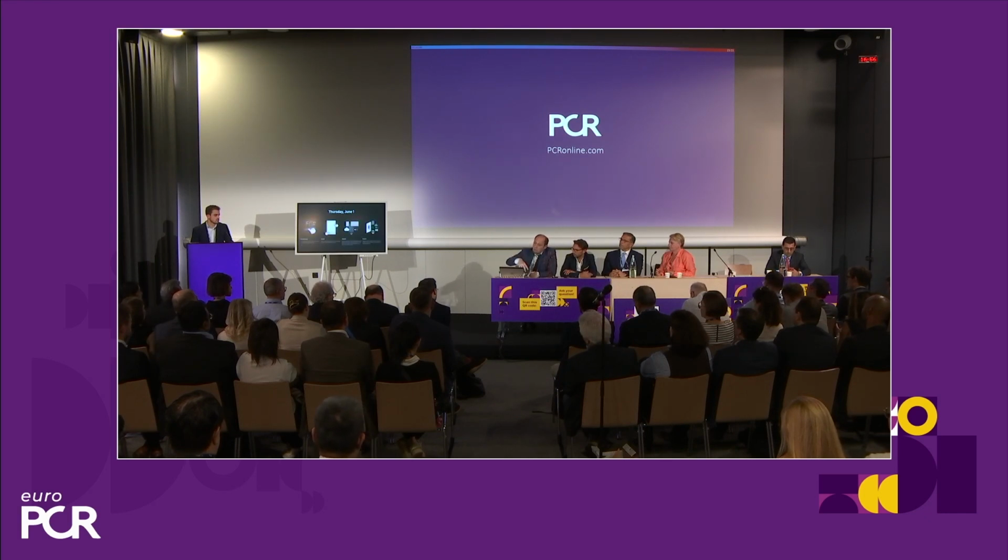So you are focused on the treatment of the MI patient, you treat the culprit lesion, you stabilize the patient, and the day after you can integrate the analysis with angio-FFR, angio-AMR, and you can decide if the patient comes back to the Cath Lab to treat the non-culprit lesion or goes home with a very good prognosis.